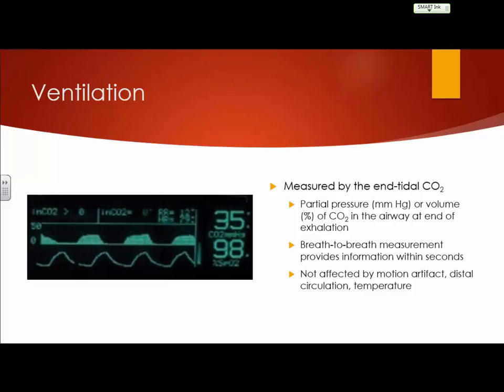The big issue with your CO2 monitoring, and because they had all the children's expo stuff set up, I couldn't find the one that goes on the end of the ET CO2 monitoring.